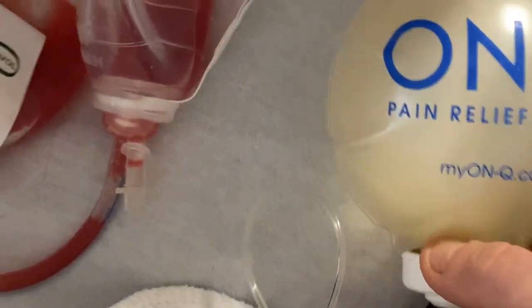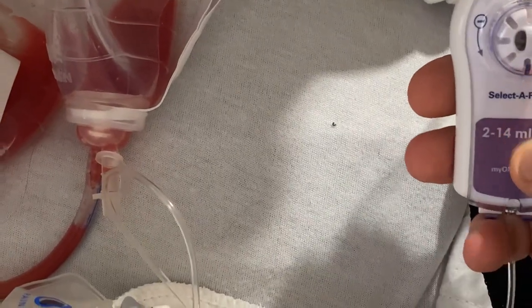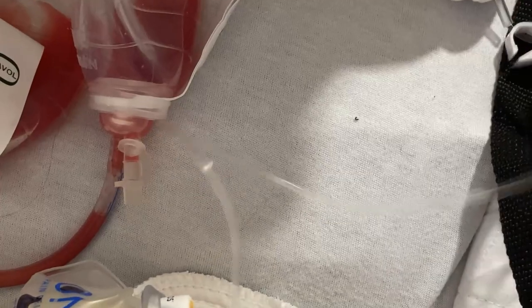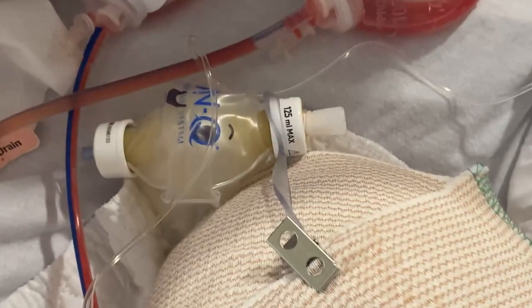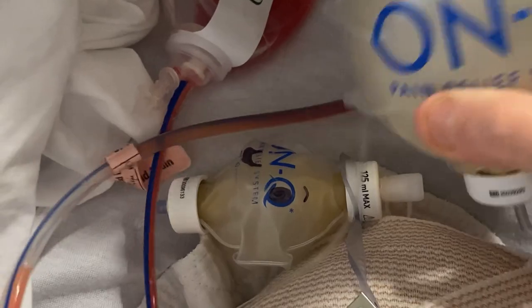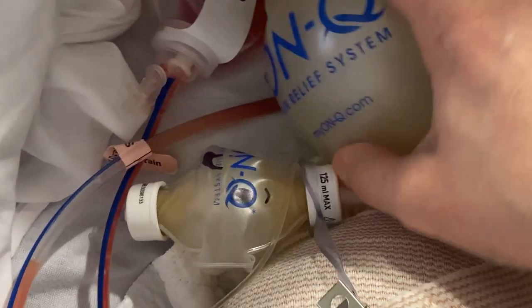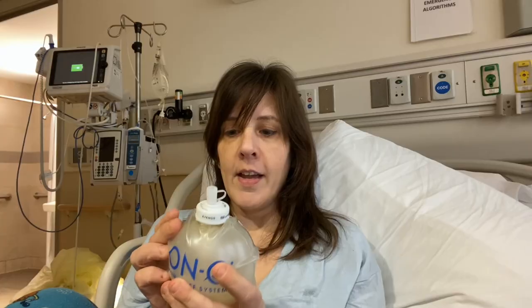This system has a little adjustment here to control how much goes into me, and then there's a catheter here that goes down — you can't really see it — but it's inserted into my residual limb.